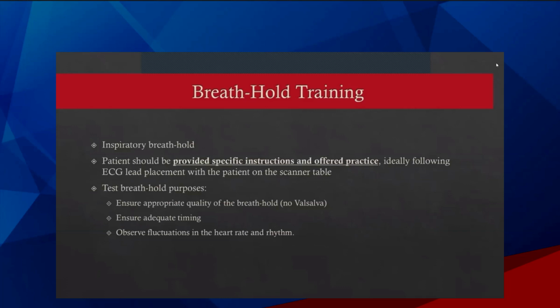And we want to time it so we take the scans after the heart rate goes down. When we inject, usually it takes a few seconds for the heart rate to go down when the patient holds their breath. So keep that in mind when you're scanning, because you don't want to tell the patient to hold their breath and start scanning right away, because sometimes it takes a minute for the heart rate to stabilize.